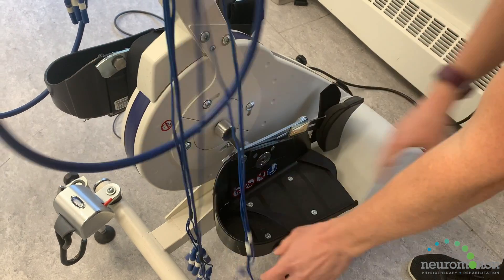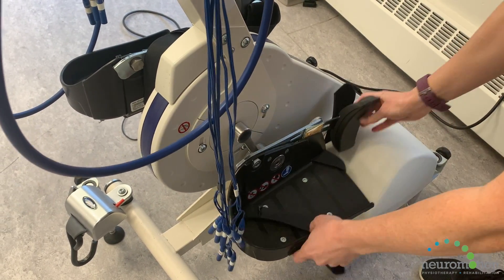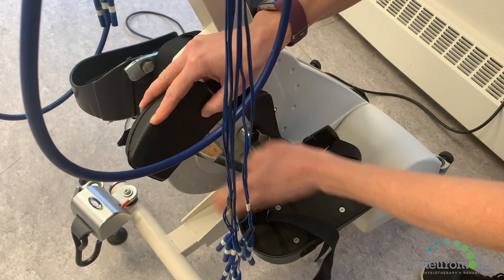We have the two foot plates, so the user will put their foot in and strap their foot in. This is the calf strap to secure the leg in place.